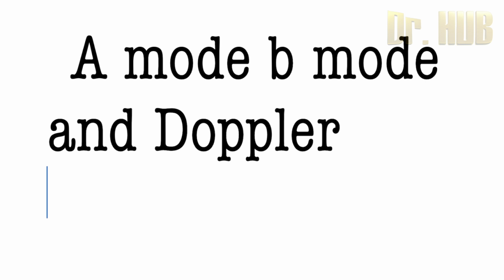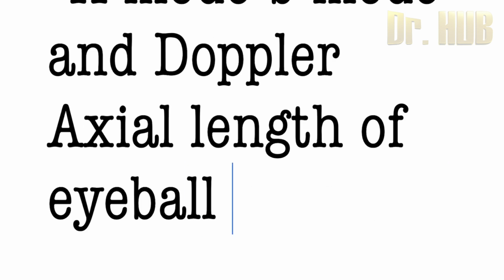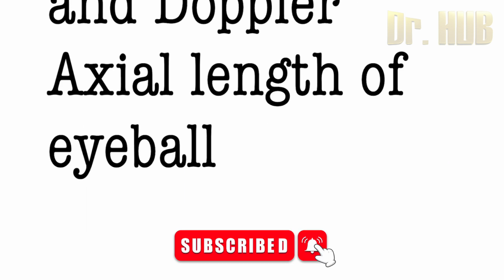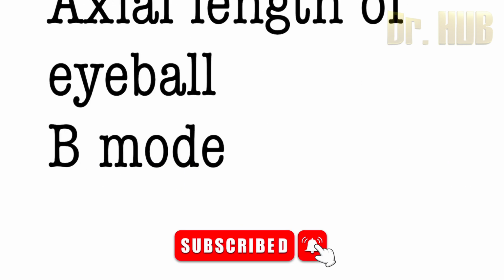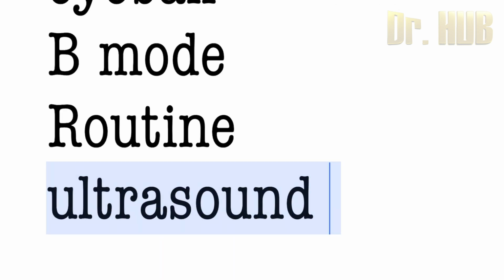So in case of A mode, it is nothing but the axial length of the eyeball. Next, moving on to the B mode. What is the B mode? B mode is nothing but the routine ultrasound.